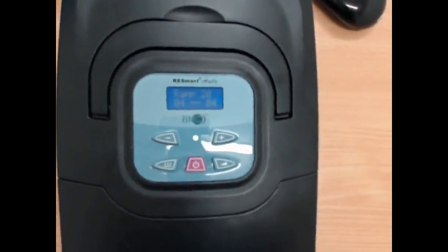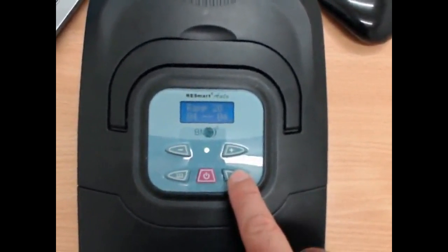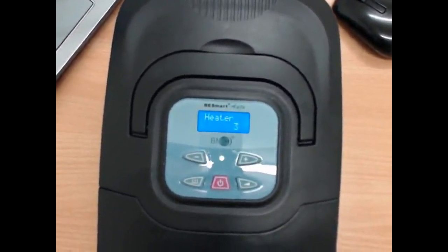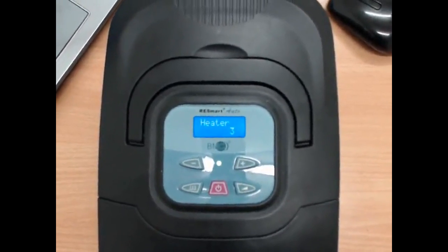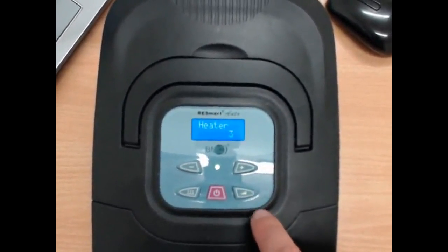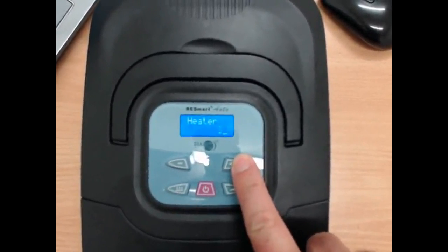So to access the basic settings, all we're going to do is this button here. Just press and hold that down for about 3 seconds. Alright, the first thing that's come up, it says heater. Now that's the amount of humidification. So at the moment that's set to 3. If we want to change that, first what we have to do is tap this button again. So that'll start flashing, and now we can use the plus and minus buttons to go up or down.